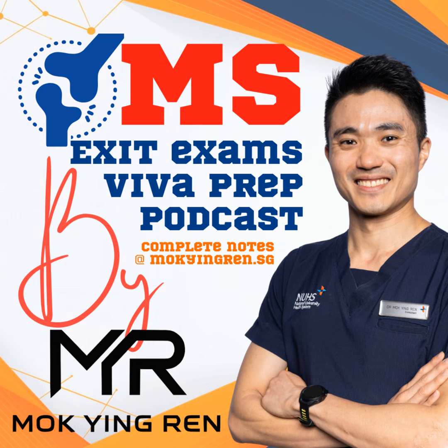So if you do decide to resurface, based perhaps on that registry data or surgeon preference, what are the technical points you must mention? Good question. What are the key technical tips? Two main things. One, make sure you don't take too much bone off the patella. The remaining bone thickness after you cut it should not be less than about 12 millimeters. Keep it substantial. Okay, preserve bone stock.